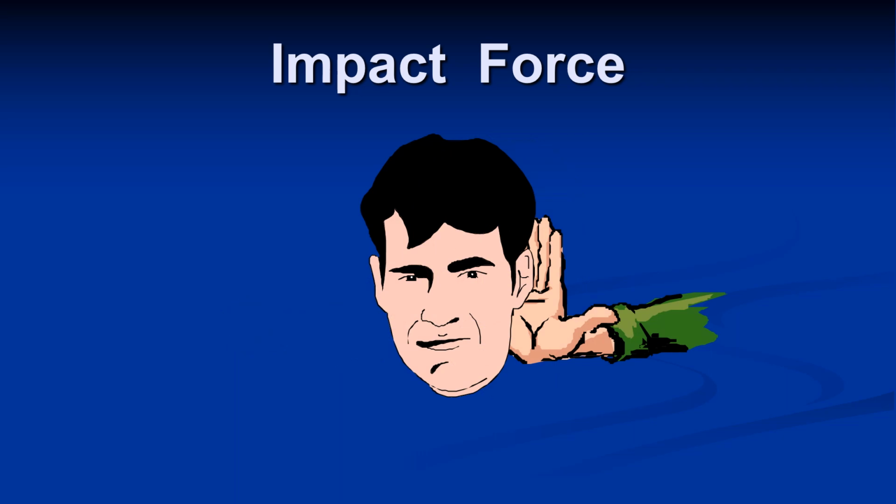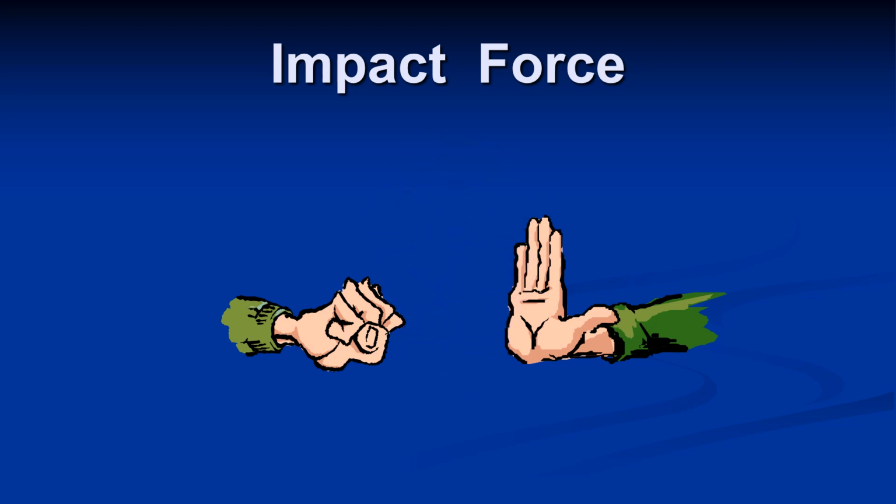But if we use another hand to hold his head and hit again with the same force, this time, he will hurt more. This is similar to Phaco aspiration. These are functions of the US power to hit the nucleus and the vacuum to hold the nucleus against the hitting force.